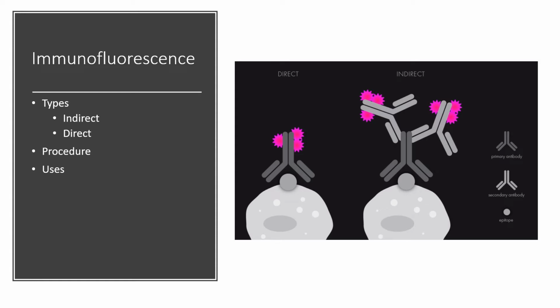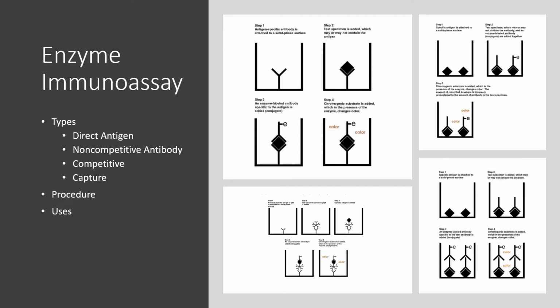Depending on the antibody present in the human serum, distinct patterns of immunofluorescence will be seen on the Hep2 cells. Levels of antibodies are analyzed by performing dilutions on the blood serum. There are four types of enzyme immunoassays, or EIAs. Enzyme immunoassays use multi-well plates to screen for specific types of ANAs.